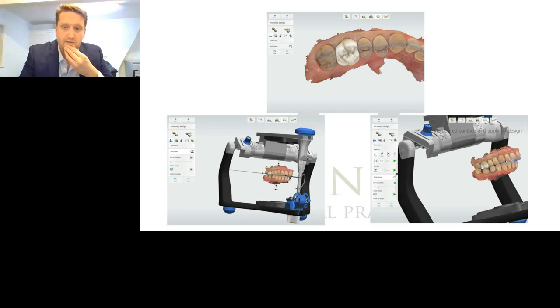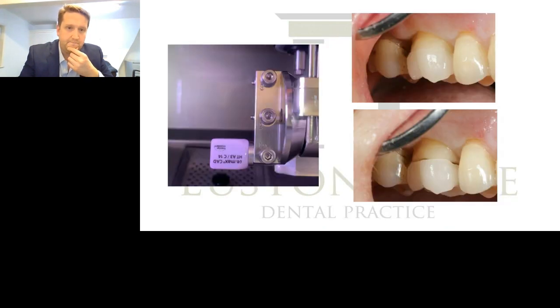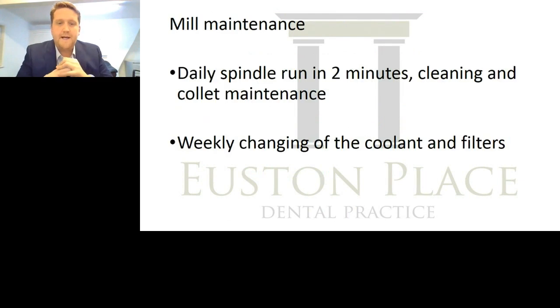And then that's a fit surface before bonding. And then we got a really nice marginal fit and blending of the margin of the tooth. Once we're finished, then again, that's the same bonding protocol there.